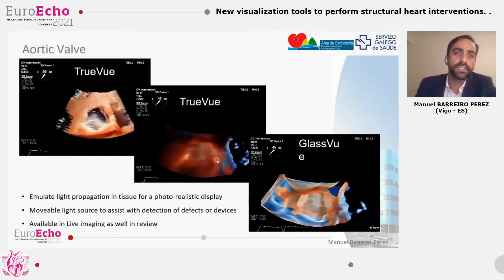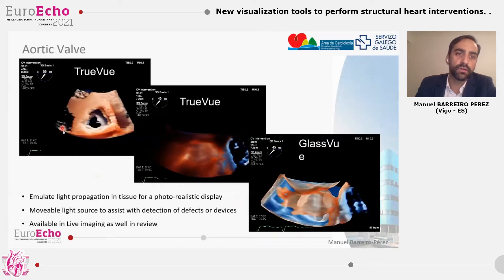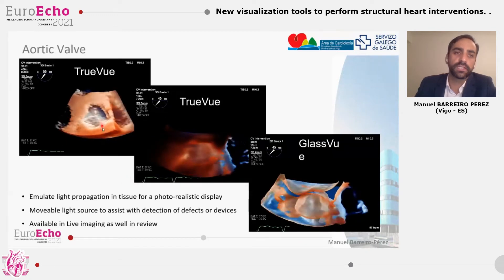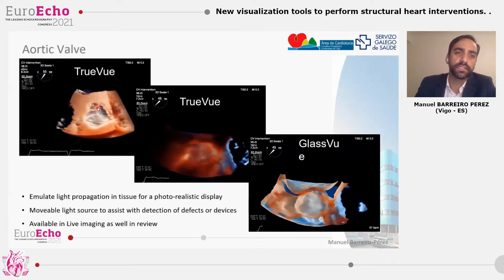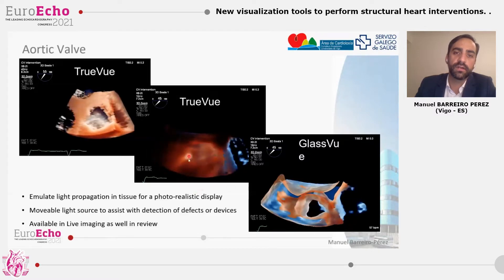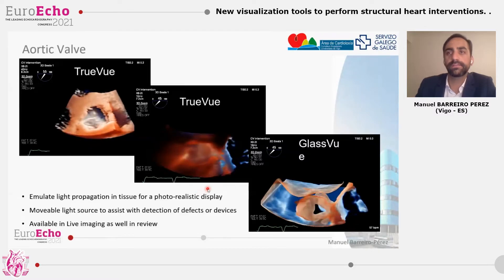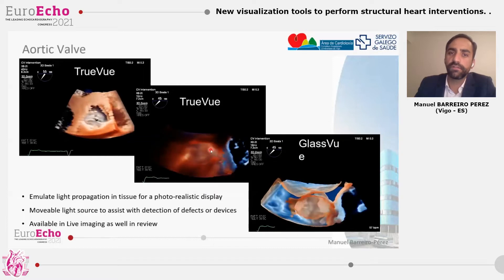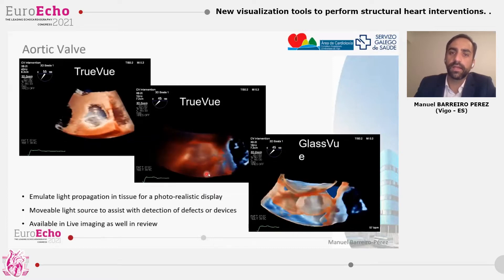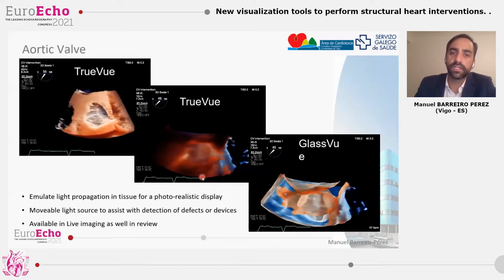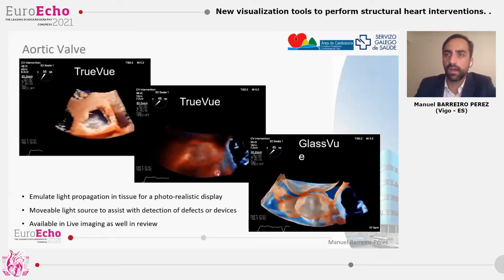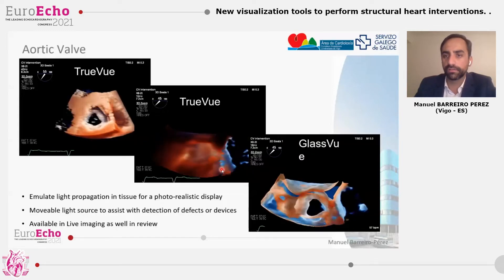For example, on this aortic valve seen on a face view, the light is in front of the aortic valve and we are seeing the opening and the leaflets. But here the light is behind the aortic valve, so we are studying the leaflet properties by transillumination, and the opening is pretty clear by the light crossing through the aortic valve orifice.